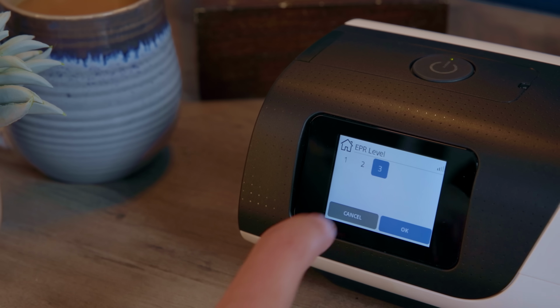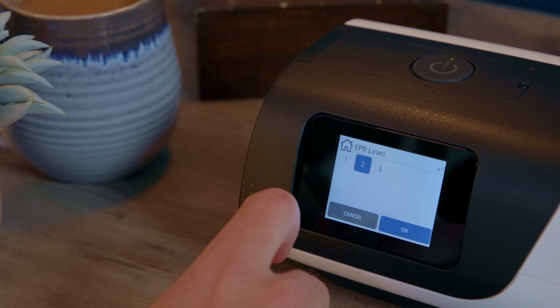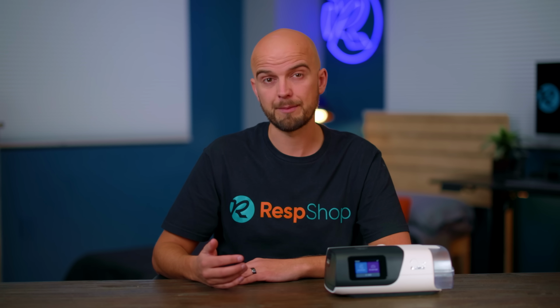Next, there's EPR level, which sets how much the pressure drops off when your machine detects that you're exhaling. The number can be set between 1 and 3. And this indicates the amount of pressure that will drop on your exhalation in centimeters H2O. So 1 will drop your pressure by 1 centimeter H2O, and 3 will drop it by 3 centimeters H2O. This means that the higher the number here, the greater the pressure drop on your exhalation. Like my other advice, feel free to experiment to get this just right for you. 3 is normally fine as long as it doesn't affect your therapy, but set the number lower if you find that that works better for you.